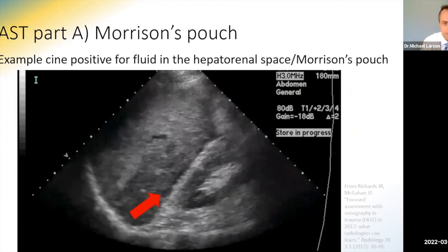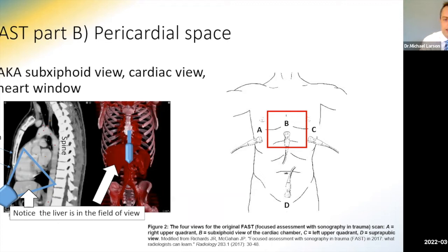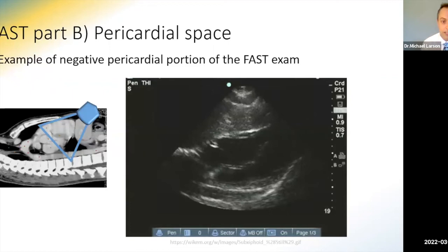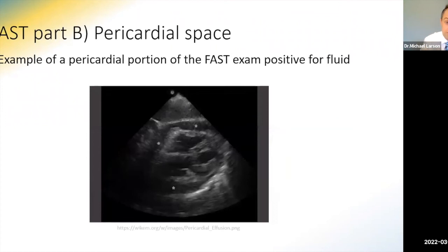The next part of the FAST exam is the subxiphoid fluid view or cardiac view. The transducer is placed sub-xiphoid to peek at the heart, and the liver will be in the field of view. A negative pericardial FAST exam shows a little liver up top and anechoic blood inside the heart chambers, but no fluid around the heart. A positive pericardial FAST exam shows anechoic pericardial fluid surrounding the heart — the authors typically mark it with stars. A real-time cine clip demonstrates pericardial effusion.